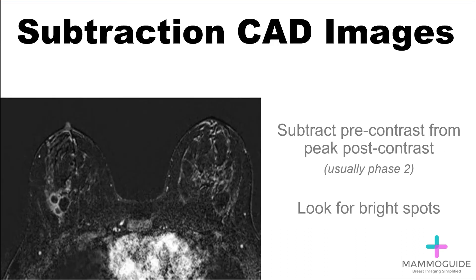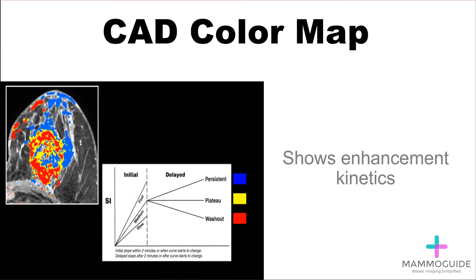Using the computer-aided detection software, subtraction images can be created where you subtract the pre-contrast sequence from the peak post-contrast sequence, which is usually phase 2, making evaluation for bright spots much easier. Computer-aided detection color mapping can be useful to evaluate the enhancement kinetics. The software also allows for creation of enhancement curves to tell whether a lesion has persistent, plateau, or washout kinetics.